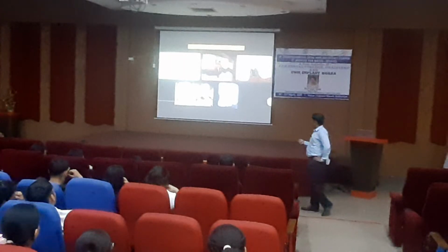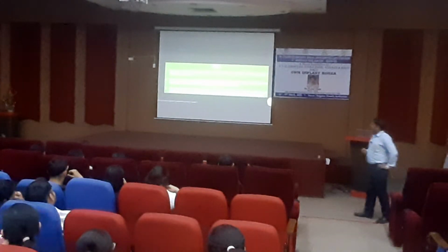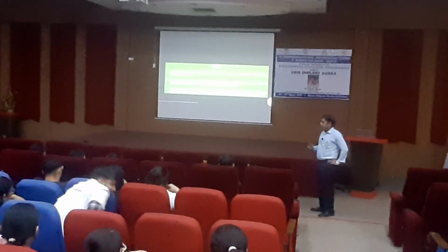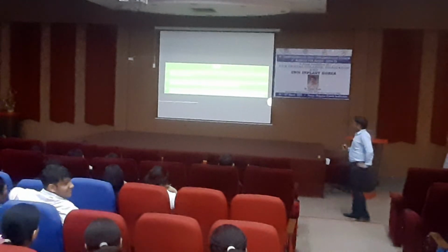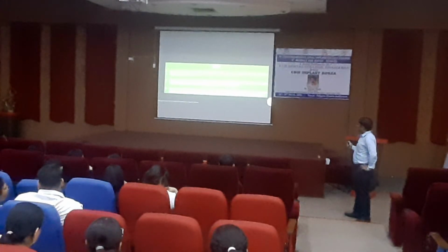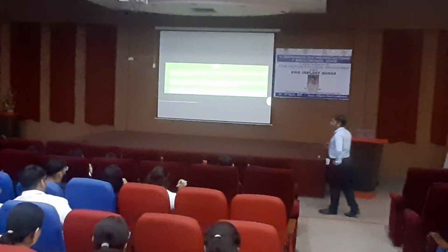The goal of ridge expansion is basically to expand the ridge to allow the placement of an appropriate size of implant. That is the first thing. Second, bone, due to its dynamic viscoelastic nature, the thinner ridges like 3.5 can be expanded with better instrumentation with less risk for fracture, trauma and bone perforation.